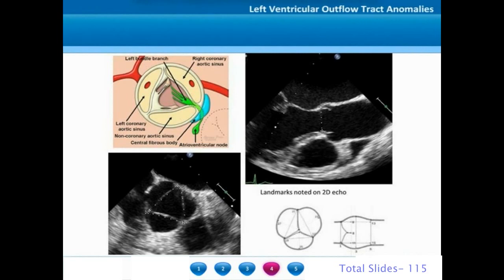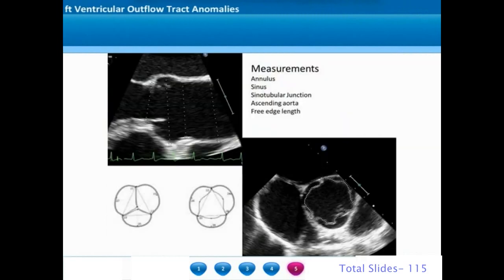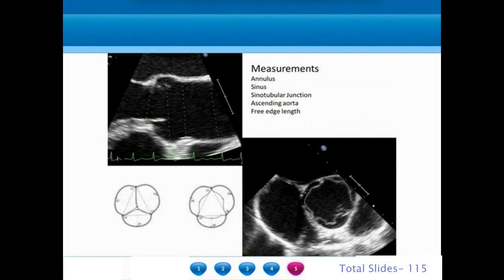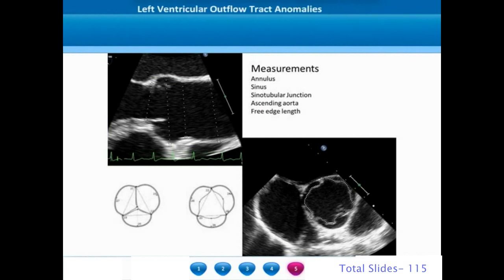We also measure the free edge length of the aortic valve. On the long axis, the various measurements made are aortic annulus, aortic root, sinotubular junction, ascending aorta, and on short axis the free edge length which is taken in systole.